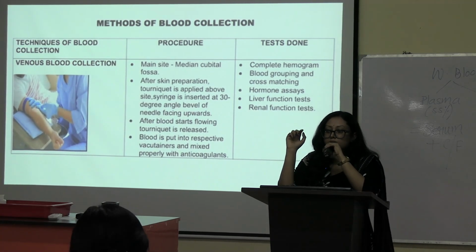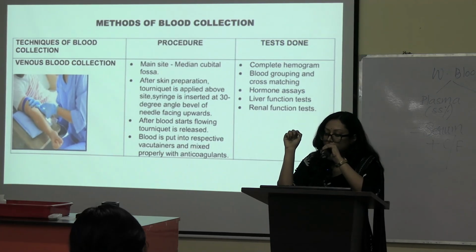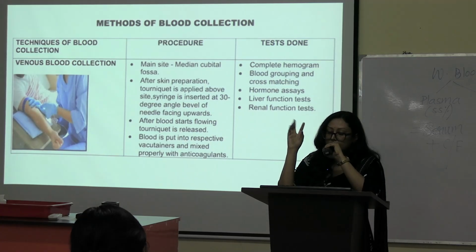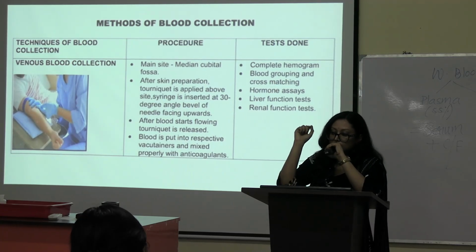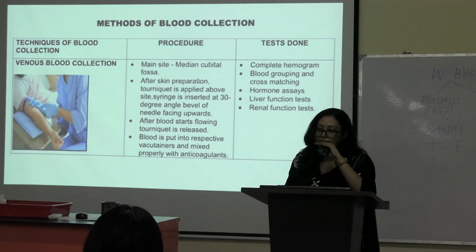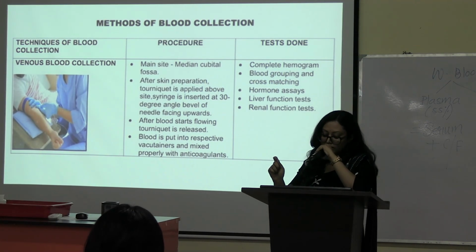Why? Because from outside we can introduce infection to the site of collection, right? So we don't want that. That's why we always clean the area from inside to outside. So after cleaning, we will use the syringe.